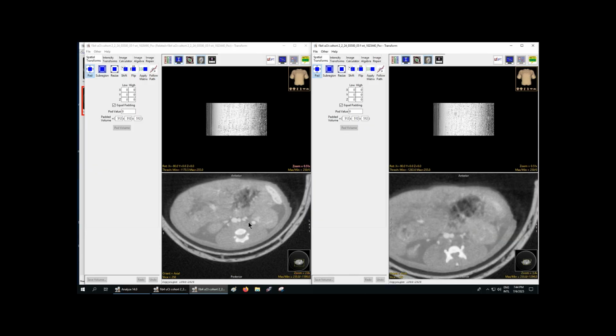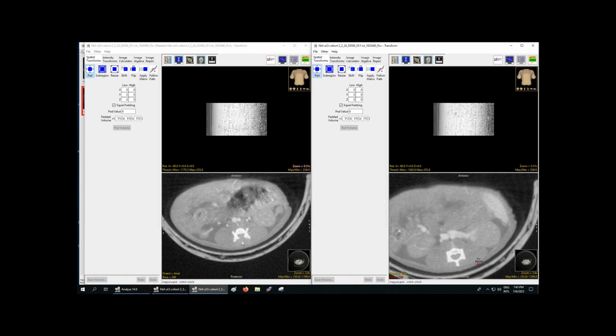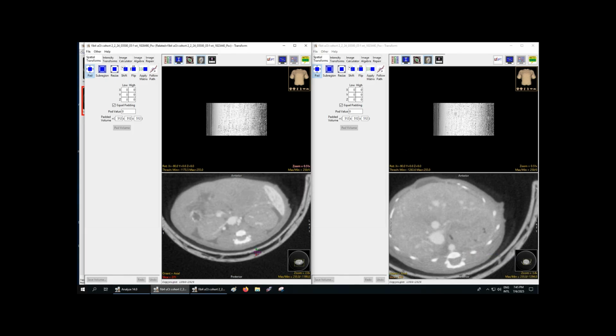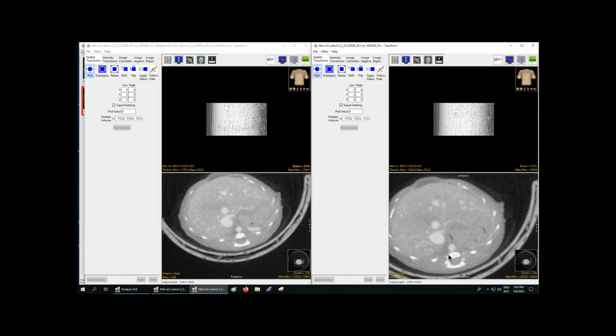In particular, the one common object that I would like to use in most cases is the pancreas. It is always very clearly defined, and so you can either use the bottom or the top, depending on which one is more clear. So here we have the top of the pancreas here, and we have the top of the pancreas here. And so now we're just scrolling up until the pancreas disappears.